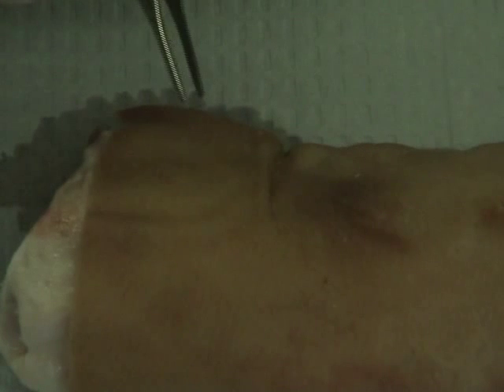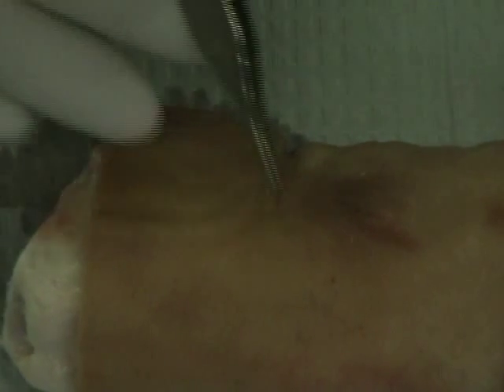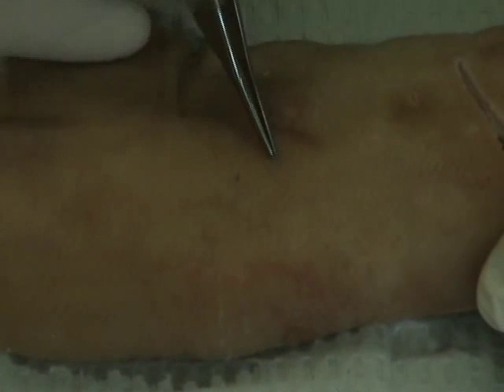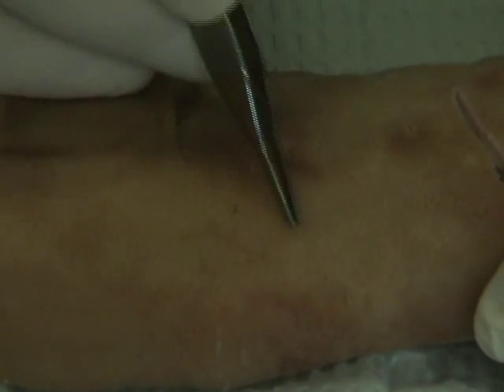So this method of curving the ellipse is allowing us to, one, follow skin lines as they curve perhaps around a person's mouth or perhaps around their eyes or ears, something of this nature. But at the same time, it's allowing us to minimize the effect of the actual suturing itself. So let's say, for example, the skin lines on this pig typically go straight across here on the pig, as you can see. But let's say, for example, that the skin lines are curved on the pig for whatever reason.